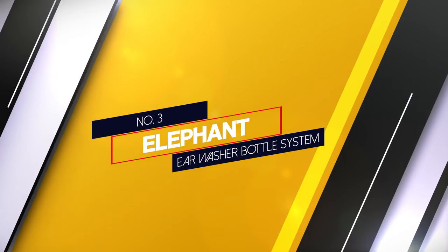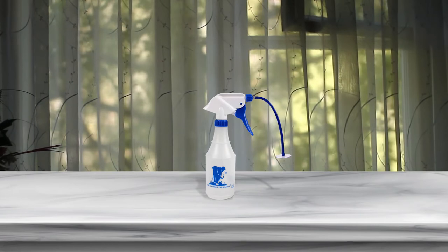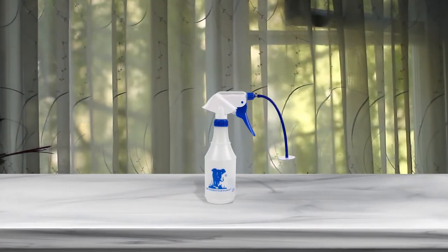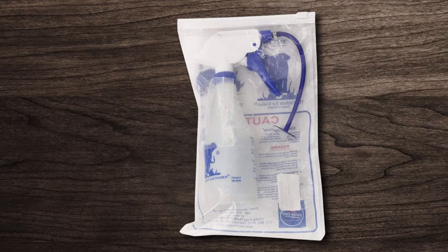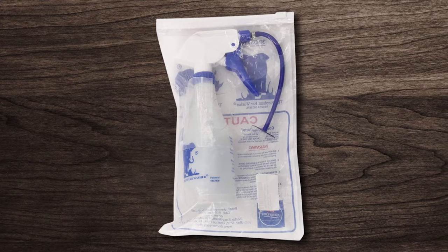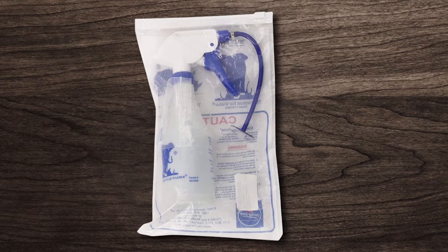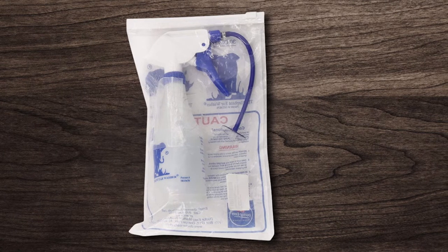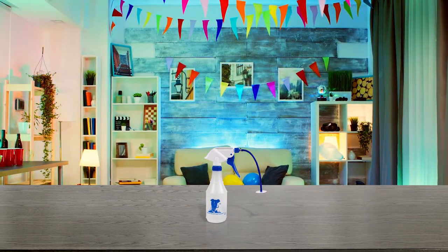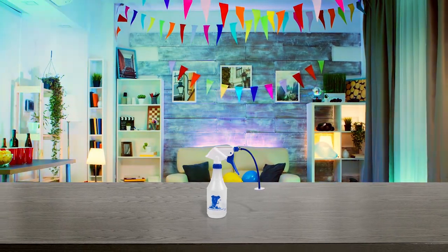Number 3: Elephant Ear Washer Bottle System. This irrigation system is ideal because it offers a simplistic mechanism involving a spray bottle with three disposable tips. It doesn't have a lot of extra bells, whistles, and complicated parts that make earwax removal intimidating. Easy to use — fill the bottle with an ear cleaning solution, twist on a disposable tip, and squeeze the trigger handle to spray the solution into the ear canal. Easily position and operate the elephant ear washer with a single hand, allowing you to use your other hand for an otoscope or other instruments.